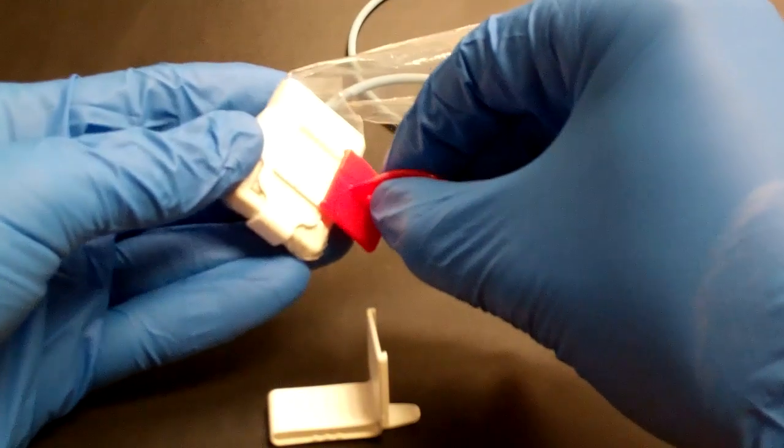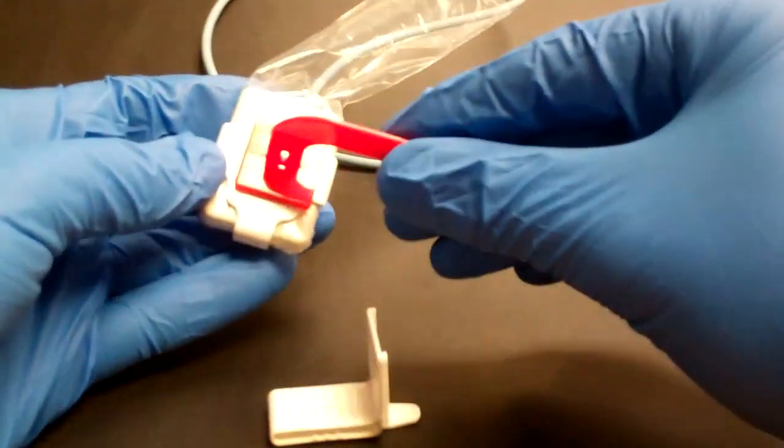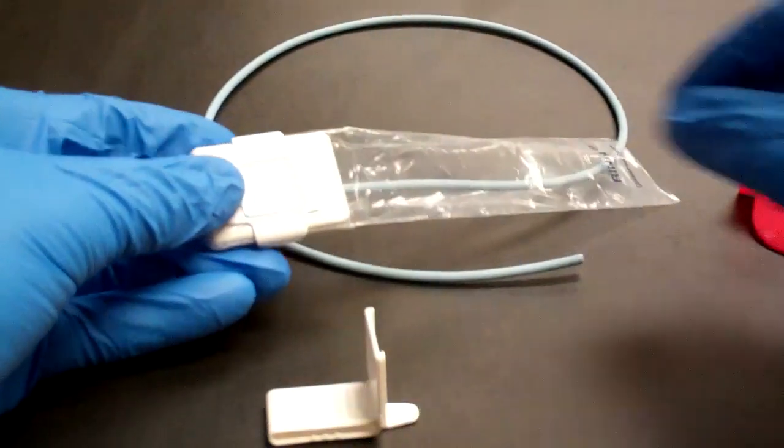If we wanted to do a vertical bite wing, we would just attach it from the side. You can see one bite piece is all you need for bite wings.